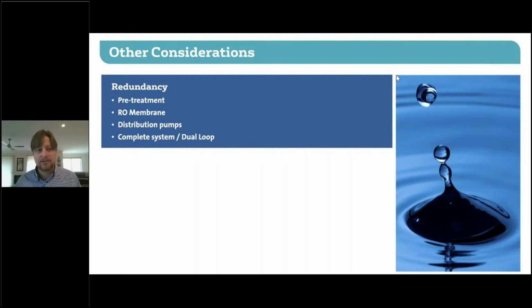That's your production house for your water. So having a dual membrane train with dual booster pumps is certainly very sensible. So if you have an issue with one booster pump or one membrane set, the other one can take over. Typically, they will both run together during normal operation, so they won't have to work as hard, but it just means that you design so that if required, one membrane train can cover your full requirement.